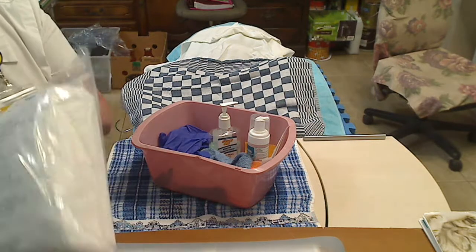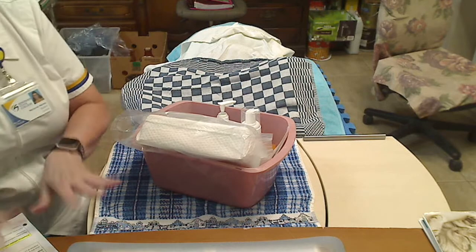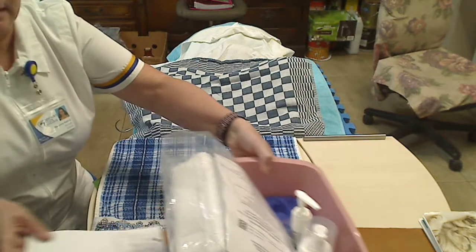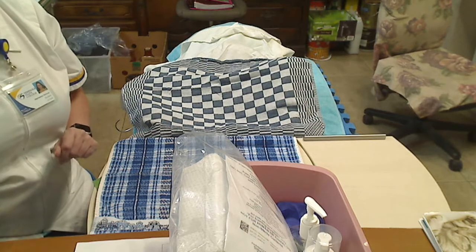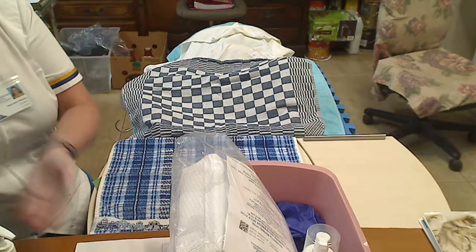So I will go ahead and take the rest of my supplies, pile them all within my container so that I can go into the patient's room, keeping my EHR with me. So the first thing I'm going to do is knock on the door, introduce myself, and make sure that she has privacy by closing the drapes. I'm going to hand sanitize as I walk in.